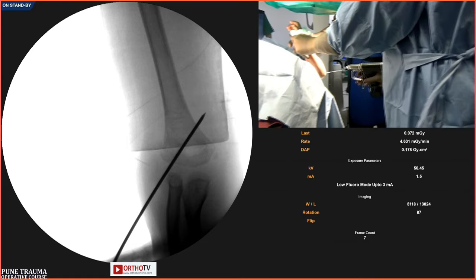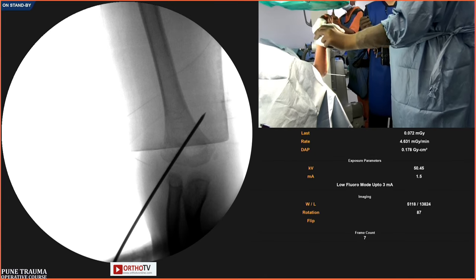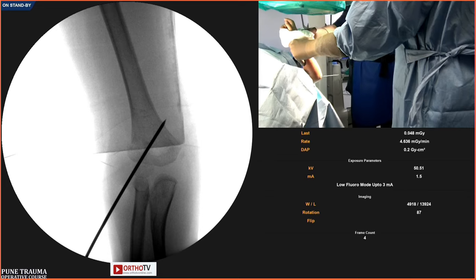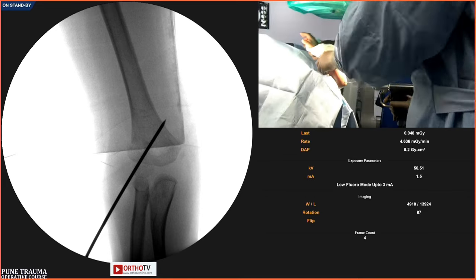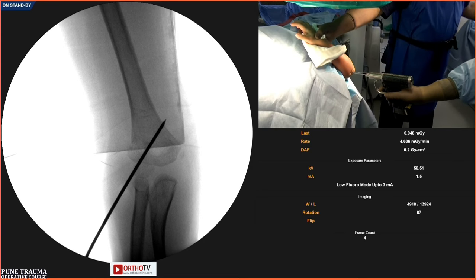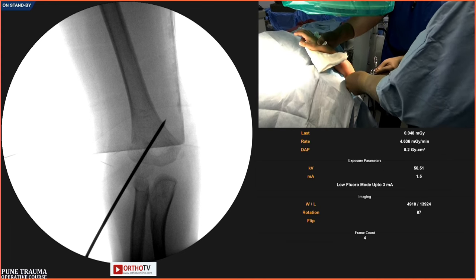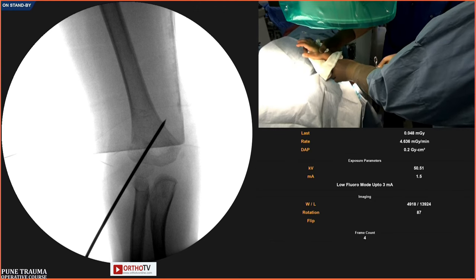So I will adjust the length of this wire by withdrawing it a little because I think it's too much. Okay, now this is perfect. Can you see, Taral, the AP film now? Yes. So now what I'm going to do is the second pin goes in the AP. Can you just put a wire on the skin and show us how you would want the second pin to go? So 1 centimeter away, and it's divergent, isn't it? And now I'm going to target the column. All right, so I'm on the bone and parallel on the column.